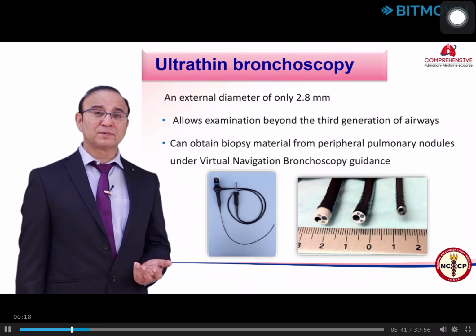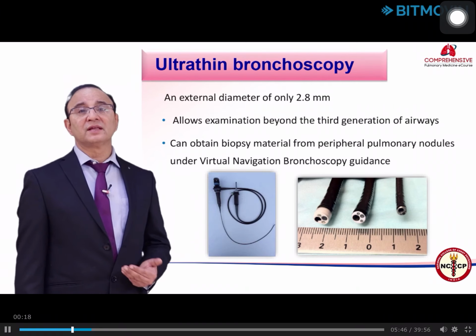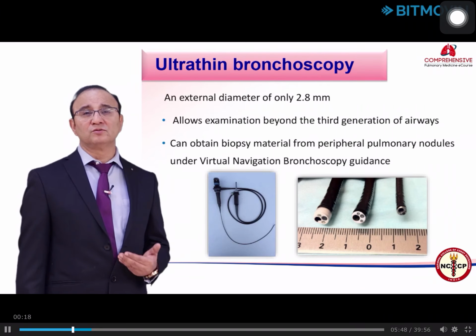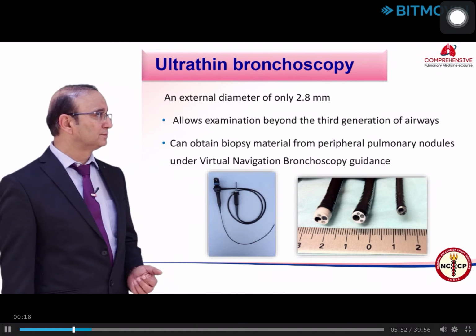Now, it can be combined with virtual navigation bronchoscopy to obtain samples from peripheral nodules, masses or lesions with the help of the ultra-thin bronchoscope.